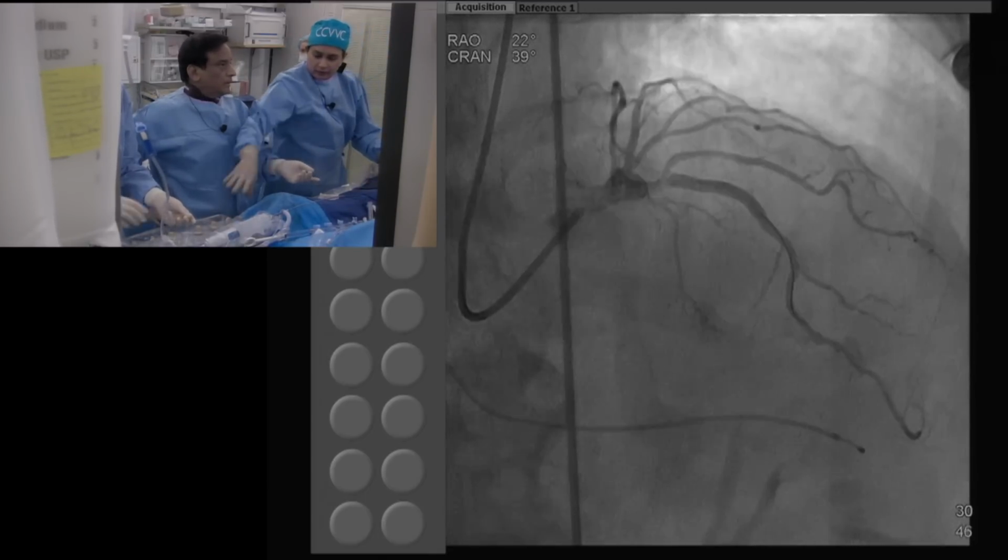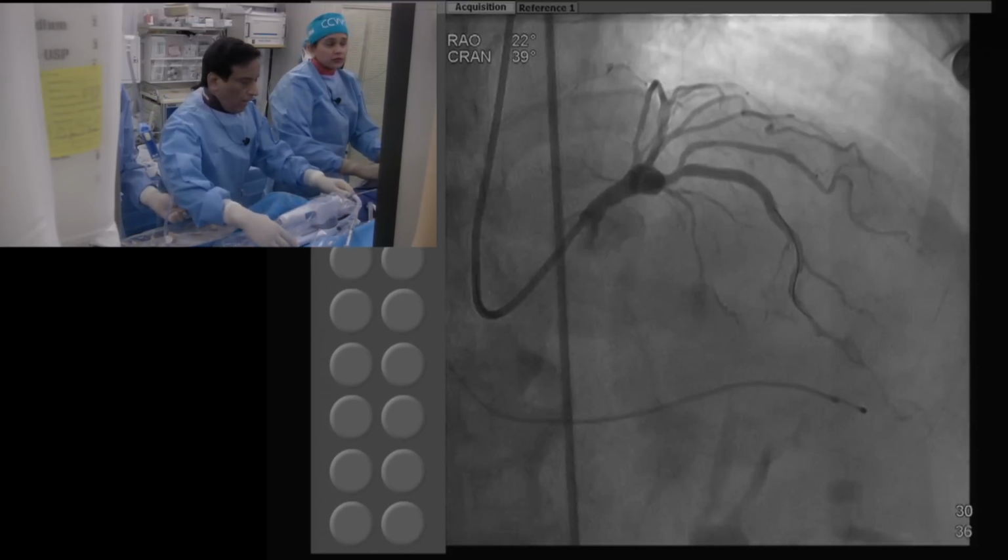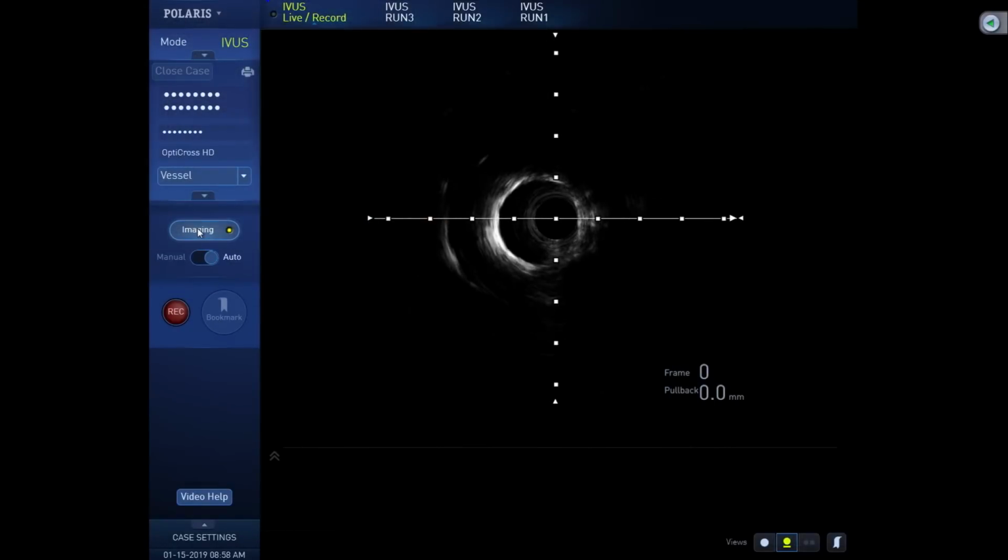Yeah, go. Why are we on IVUS? We are on, right? All right, let's do IVUS, and Samin, then you need to cover your second topic too, which is increasingly important and keeps coming back to haunt interventional cardiologists.